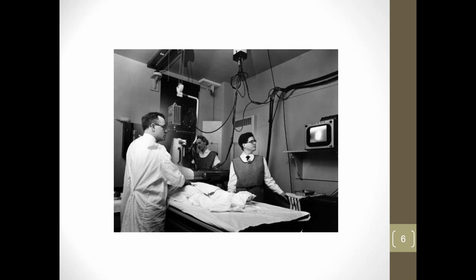Here's an early cath lab from about the late 50s. They were up and running and getting along with the technology even that far back. Right here is the view screen that the physician would have been using to view the images. Could you imagine the cardiologists and radiologists trying to use something that small? They'd be burning down the lab before they put up with that.